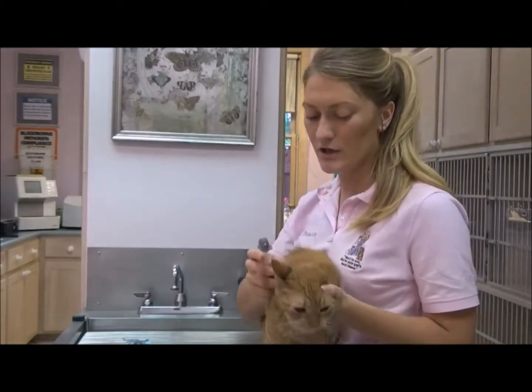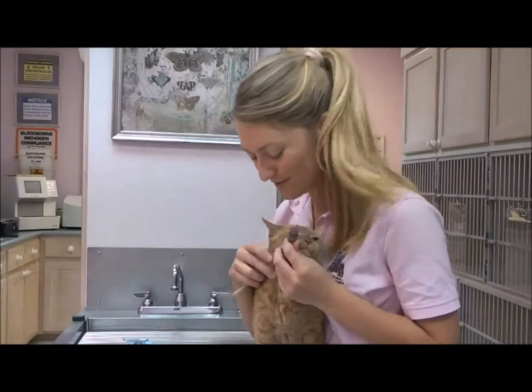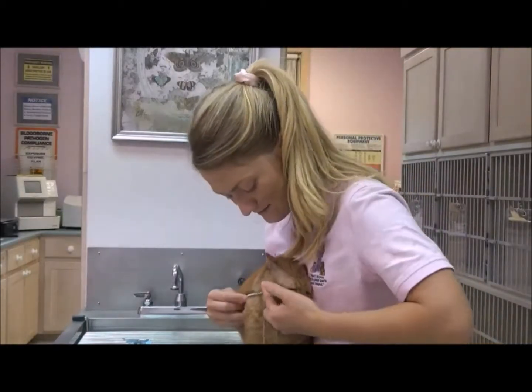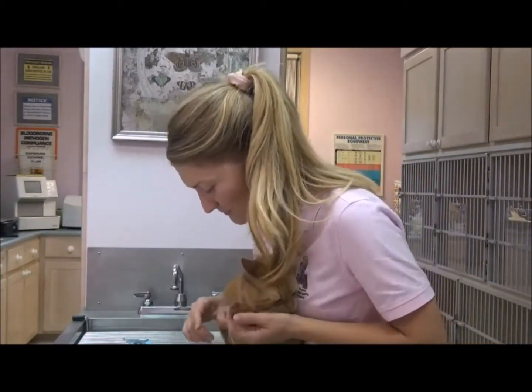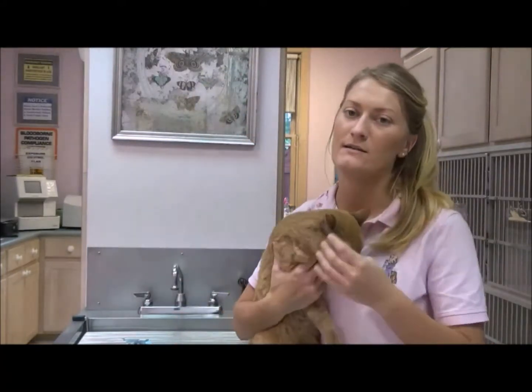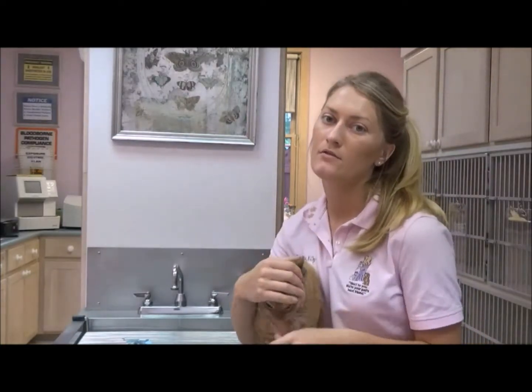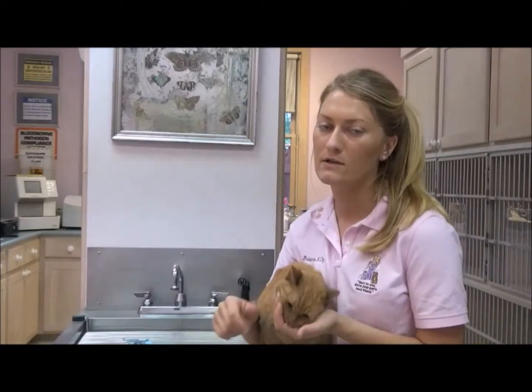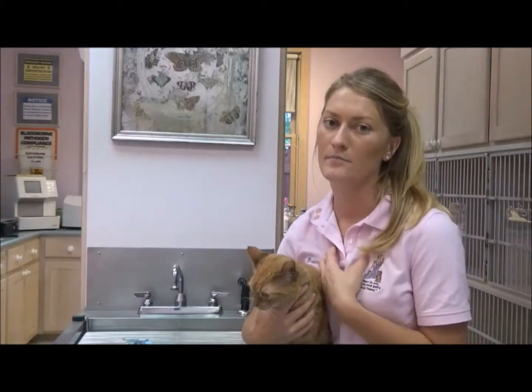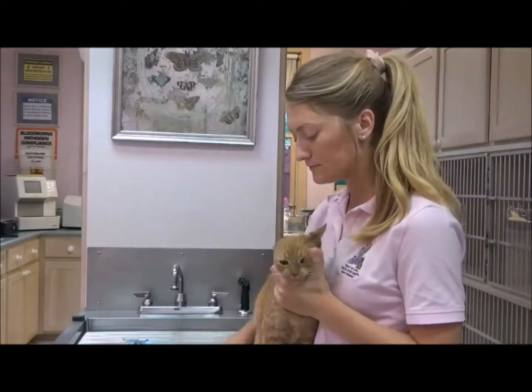But you also want to measure and make sure that the tube is long enough that it goes from the tip of the nose to the thoracic inlet. So she's probably about a size 4. But like I said, it's best to have a couple different options ready as well. You also want to make sure that the tube is small enough that it doesn't cause any damage to the trachea, but also large enough that once the cuff is inflated, it'll provide that barrier and prevent any aspiration of material.